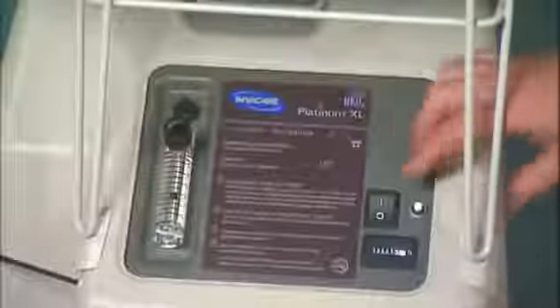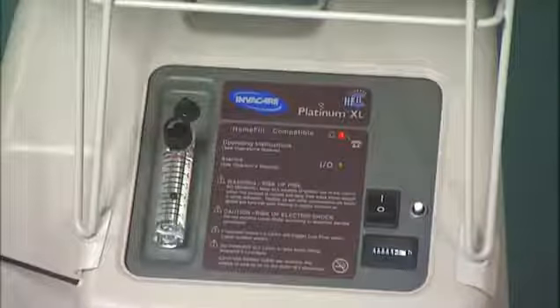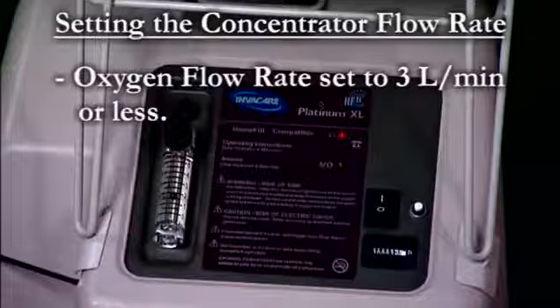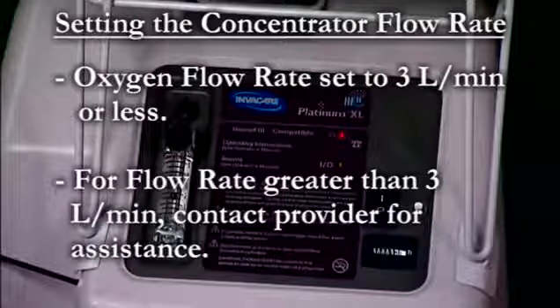The concentrator should be turned on for at least 20 minutes before using the home fill. Set the concentrator flow rate to the level prescribed by your physician. The oxygen flow rate on the concentrator must be set to 3 liters per minute or less, or the home fill compressor will not function properly. If your prescription calls for an oxygen flow rate of greater than 3 liters per minute, please contact your provider for assistance.